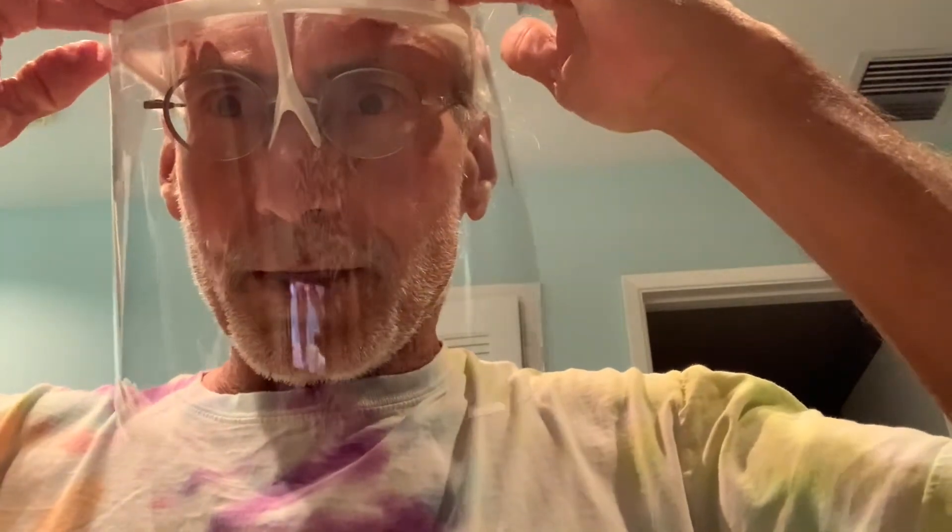And our Z-Shield is done — that's it right there. Here's our Z-Shield. It goes on just like that. It's fitting right on my face — it covers pretty low, which is good.